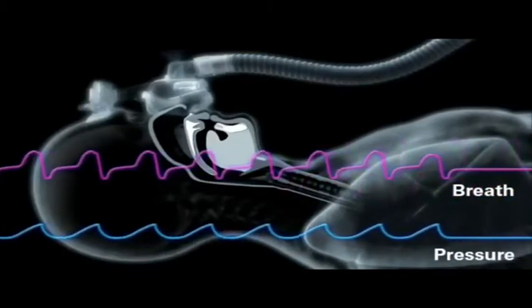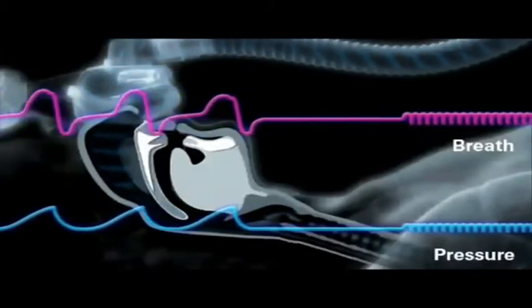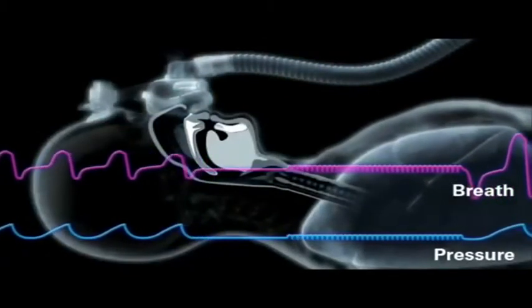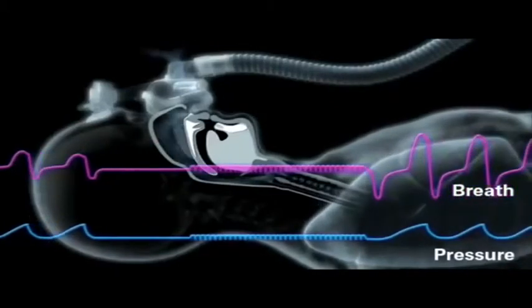However, if the airway is open, there are much smaller fluctuations in mask pressure and a relatively large flow response. Recognizing this as a central apnea, the device will not increase treatment pressure.